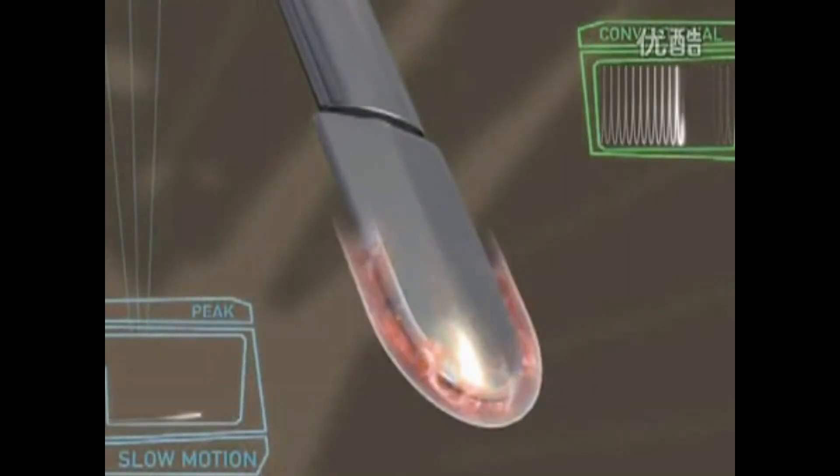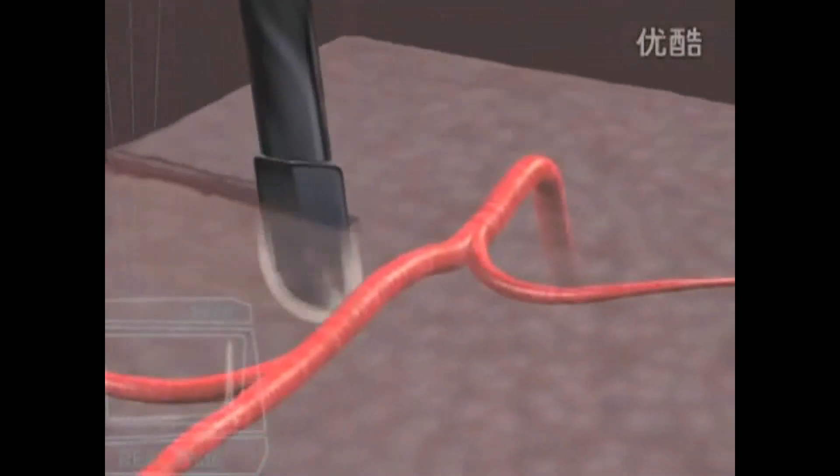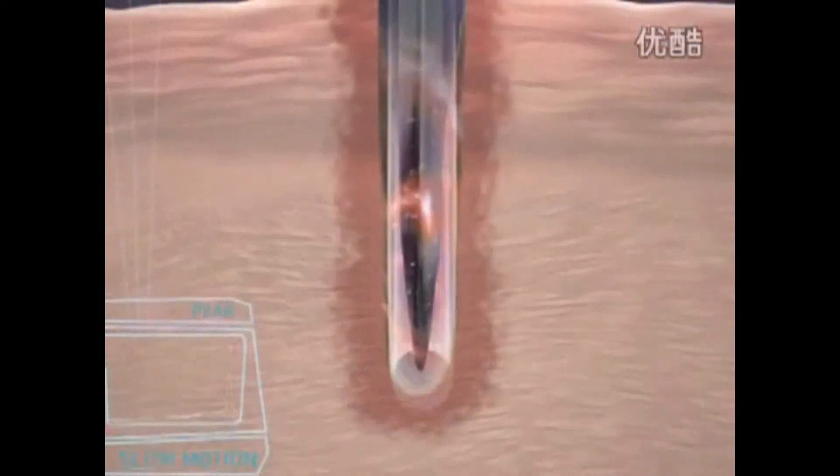Based on proprietary pulsed plasma technology, the Peak Plasma Blade cuts quickly and easily through all types of soft tissue, including skin, fat, and muscle, and works in both a wet or dry surgical field, while minimizing thermal injury to surrounding tissue.